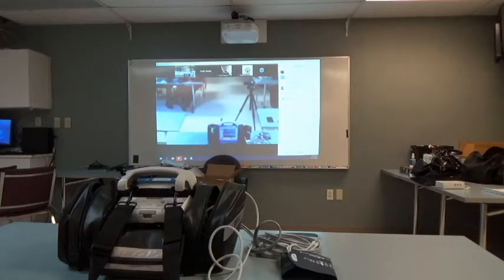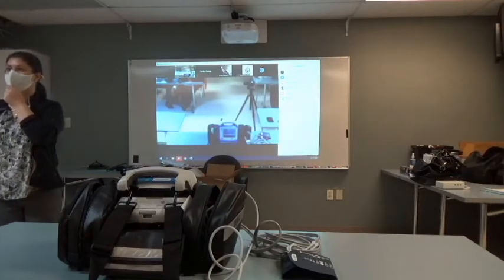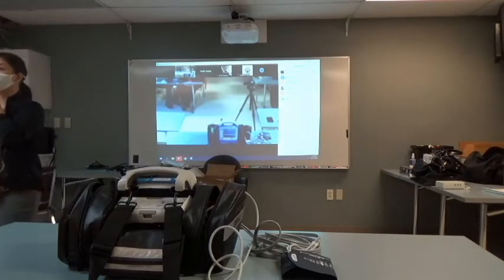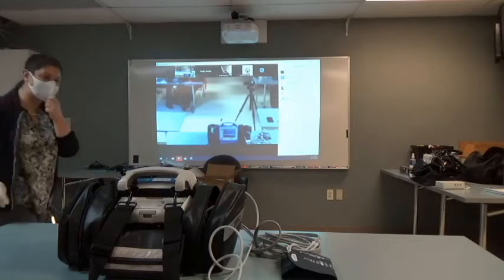If we change it to pediatric, we change three things on the device: the air pushing and pulling through the blood pressure cuff, 42 different alarm parameters in the background, and, more importantly, our initial joule settings go down to 50 to start. Let's switch it back to adult.